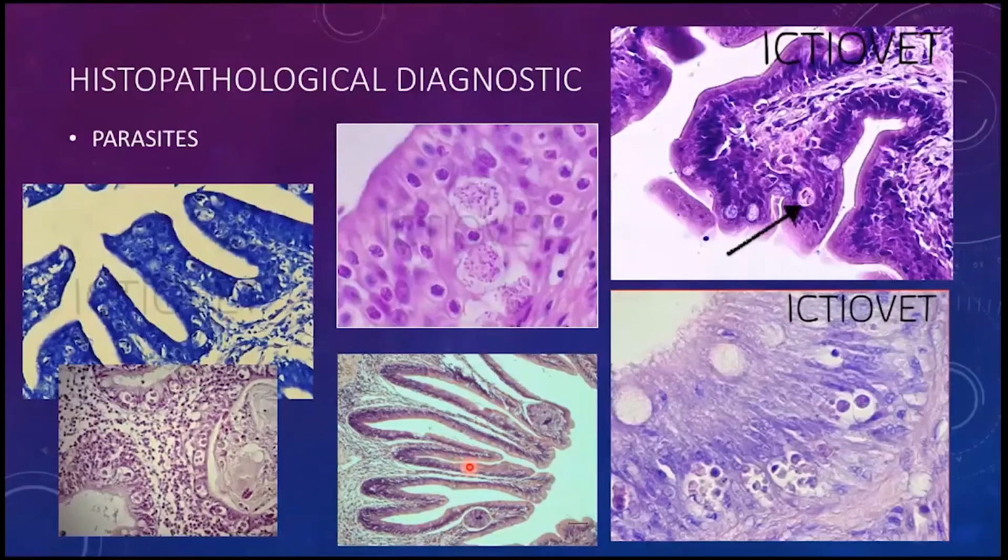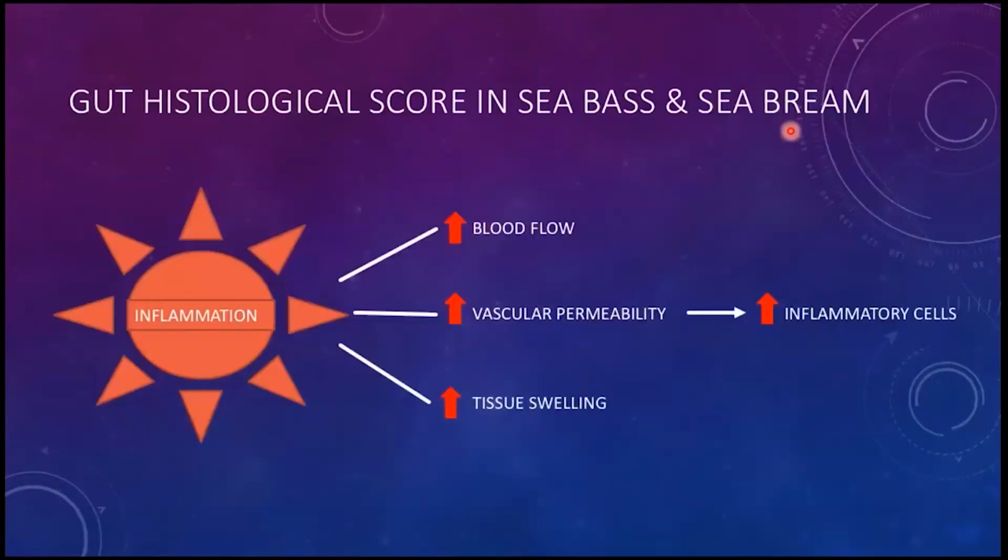Other microsporidian, Enterospora is a microsporidian, I haven't said that, sorry. But other microsporidian parasites can also be found, forming more typically xenomas, surprisingly maybe not producing such an inflammatory response. And other parasites that can be found, with variable amounts of inflammation associated to their presence, would be Cryptosporidium or Eimeria, coccidia parasites. Okay, so this would be histopathological analysis.